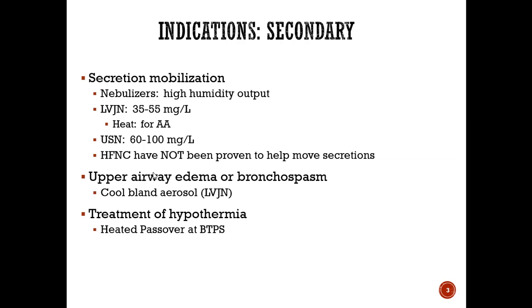Another reason that you would do humidification, if not for the first two reasons, is upper airway edema or bronchospasm. So that's more the cool, bland aerosol provided with a large volume jet neb. Again, if you think about swelling, if you have that cool air hitting it, it's going to help to vasoconstrict those vessels and get rid of some of that swelling.